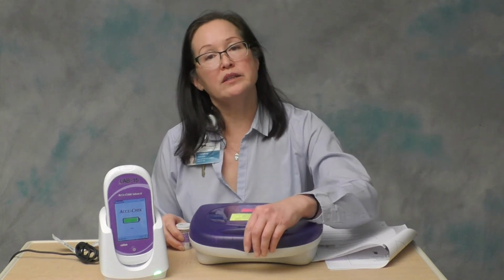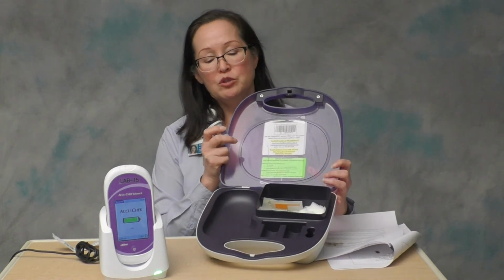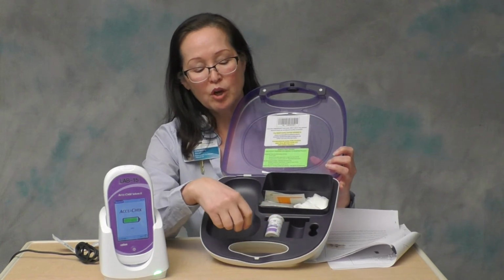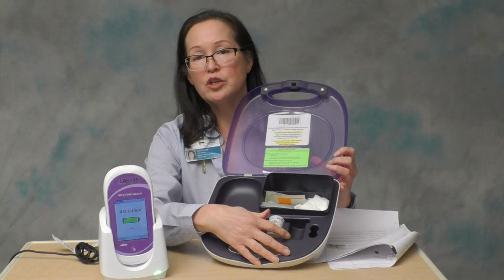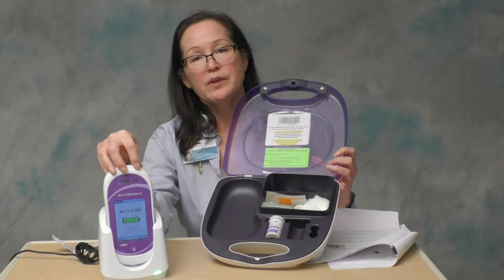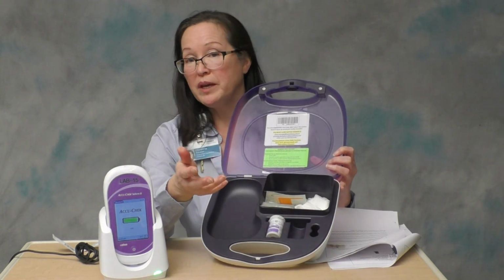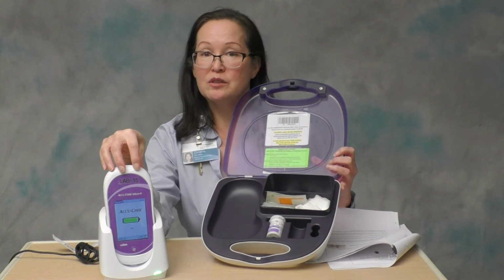And then a couple of times a year, we end up with a new lot of test strips before the old lot is all used up. Because there are spots for 2 vials of strips to be stored in the totes, you may end up with an old lot and a new lot in your tote. If someone picks up the old lot to run the meter QC, the meter will record that, but if you pick up a new lot to run a patient test, you scan that strip vial, the meter's going to tell you that it hasn't had QC run on it.